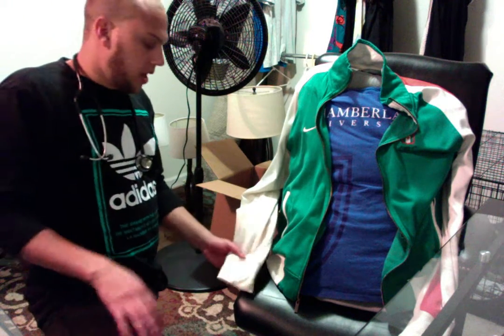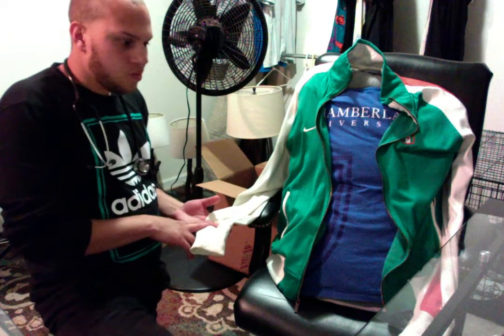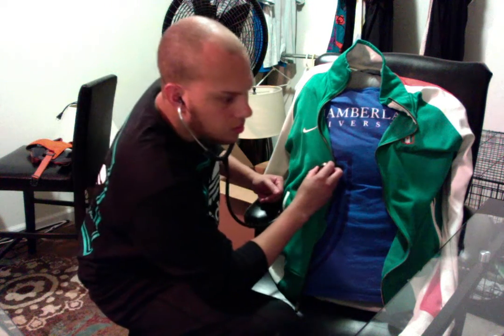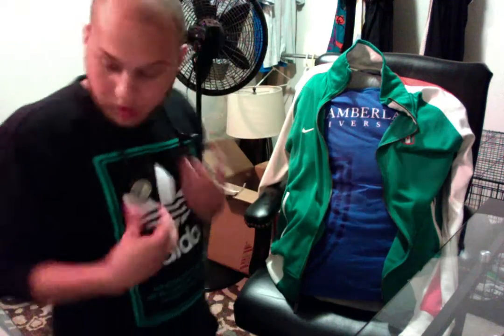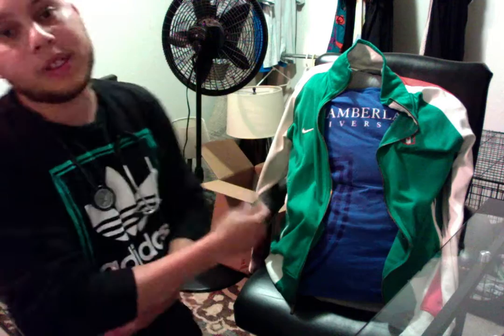So, sir, I'm just going to count your pulse here and get a few vital signs from you. So let's see. Okay, his pulse is at 92 beats per minute. Let's listen in for respirations. Okay, his respirations are at 18 breaths per minute. We're going to give him temperature. Okay, his axillary temperature is at 98.6 degrees. That's perfect. Just what we're looking for.